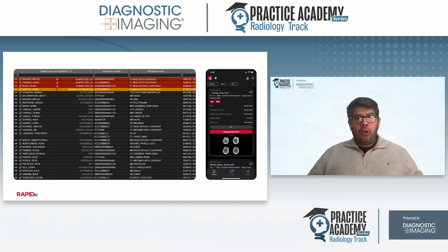When we are on the weekend call, I routinely come in and there's 60, 70 cases that we are starting the day with, and it's hard to say which case I should start with. Generally, we will just do oldest case first and then make our way to the newest case. But what if one of the newer cases has an urgent finding that needs to be looked at first? And it becomes extremely difficult.